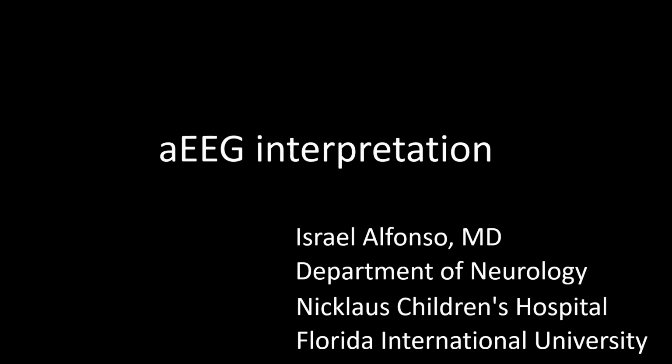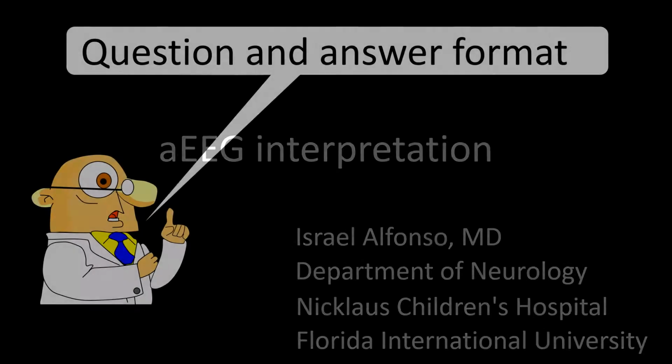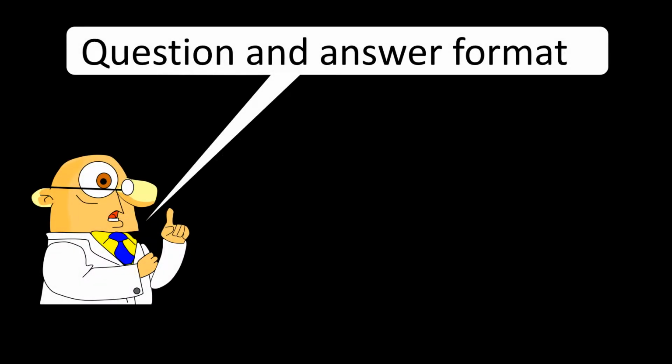The title of this talk is Amplitude EEG Interpretation. It will be conducted in a question and answer format.